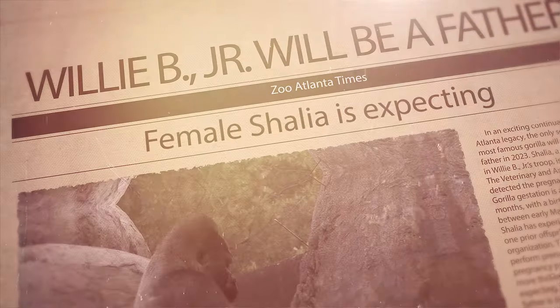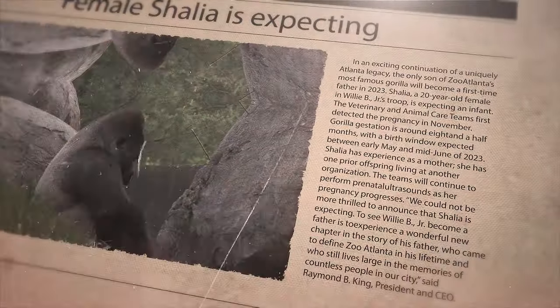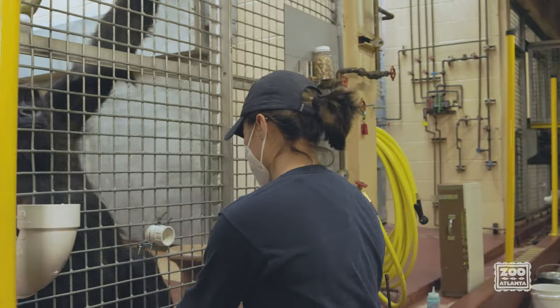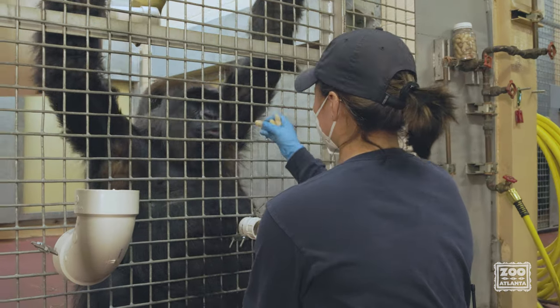Today, we've been working with Shalia on voluntary prenatal ultrasounds. Hi, I'm Kate Leach. I'm one of the veterinarians here at Zoo Atlanta. Shalia is trained and will voluntarily come up for treats and present her belly. And we can get a look inside.